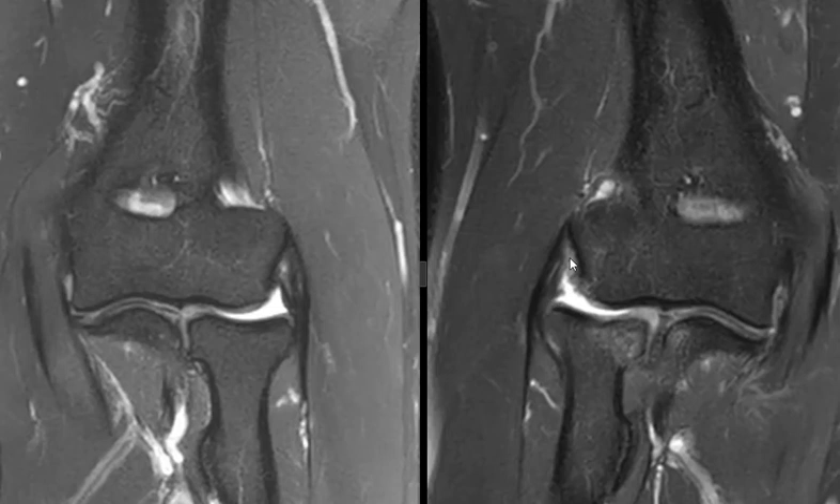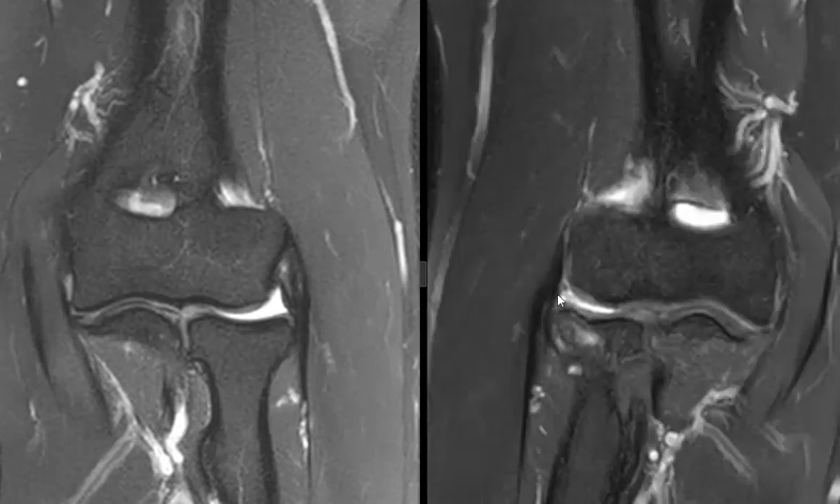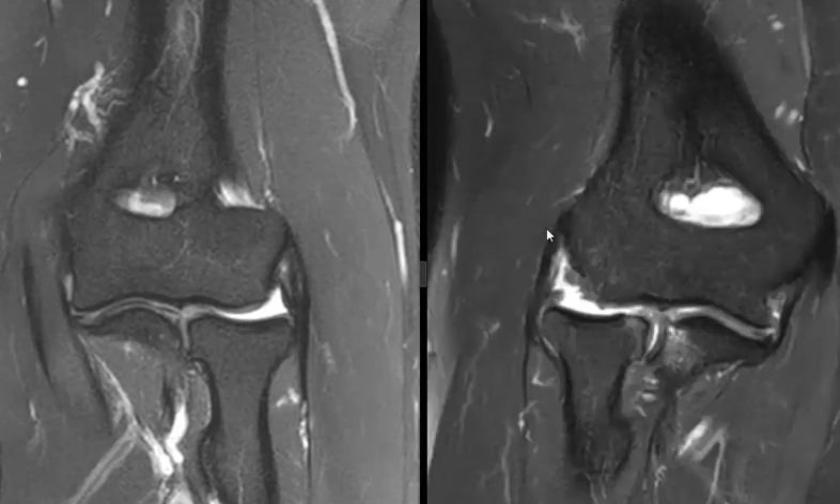Going forward, we're looking for the radial collateral ligament — maybe right here is part of it — but the attachment we just don't see very well. Also, the joint is a little bit widened here. So this patient has a ruptured lateral ulnar collateral ligament and I believe also a rupture of the radial collateral ligament. Over that, we see the common extensor tendon — the undersurface fibers are frayed and irregular, and thickened.